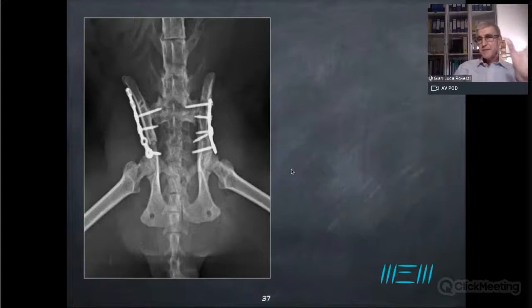What is the rationale here? Of course, this is not a complete fracture healing. We still have on the right side this kind of situation with just one screw here, but this is 5-6 weeks after the osteosynthesis. So I'm taking advantage of the fact that the external fixator protected my osteosynthesis during the critical early period of the bone healing. Now I'm taking advantage of a callus that is not complete, but it's developed enough to share the load with the plate. So we don't need to completely stabilize with the implant. We can trust the fact that we share the load.